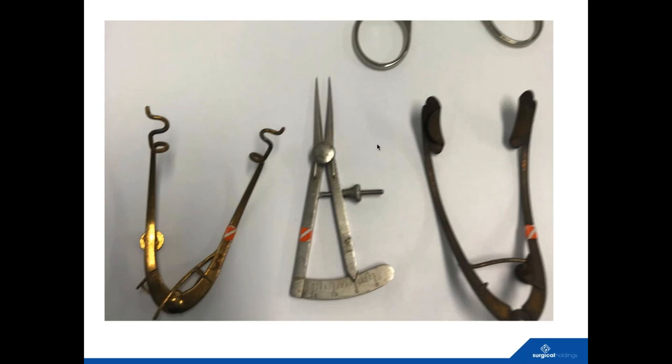I thought you might like this shot, Bob, of the three amigos here with their tape on them. This is a particular surgeon's set, and they've had to identify it. So they've got tape. For starters, the gold plating has really deteriorated on these eyelid retractors. This was on one tray, so you've got one still semi-bright gold eyelid retractor, and another that's really tarnished and shouldn't be going near anyone's eye. So vigilance, and it's common sense.